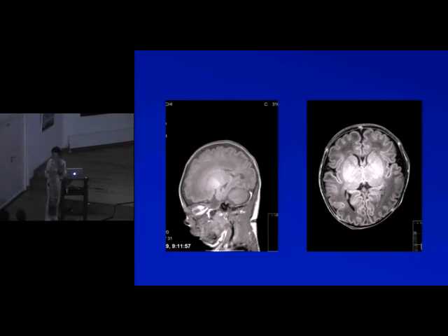So I can continue with a lot of examples, and I think you have to find out for yourself as well, just to try and see what happened, how EEG evolves over time. And I think the take-home message I really want to address is: if you don't understand your EEG and you're not familiar with it, please talk to your neurophysiologist to make it a continuous, full EEG, just to check what you're looking at, and ask other people who are more experienced to look at your traces and whether your evaluation is the right one. Okay, thank you for your attention.